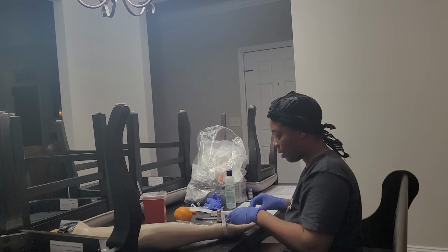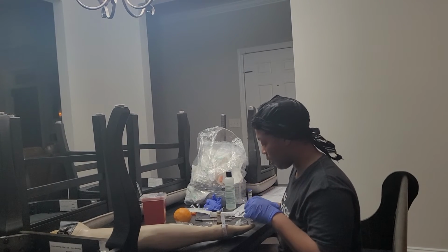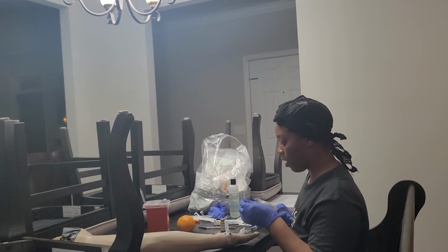Briefly recap because I need to clean off the top of my extension tubing here, and also need to flush.